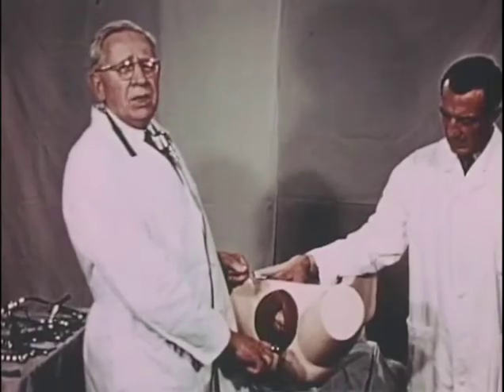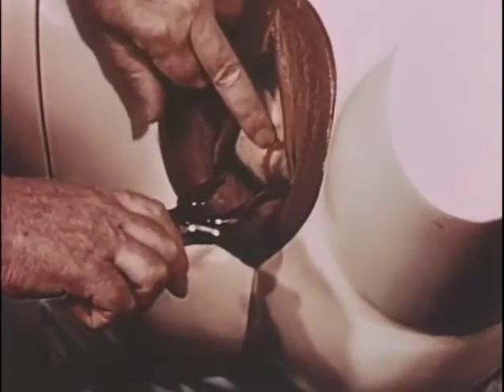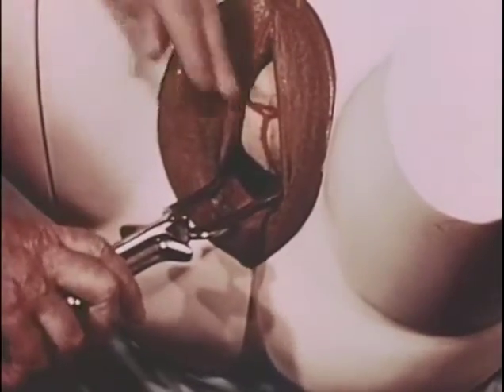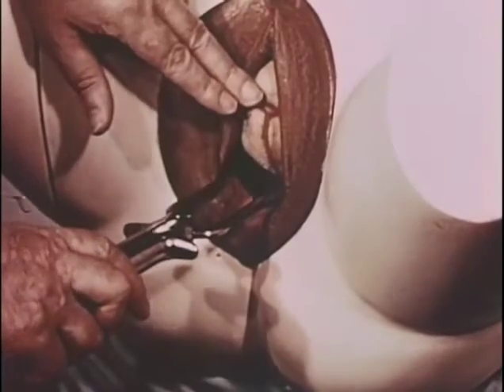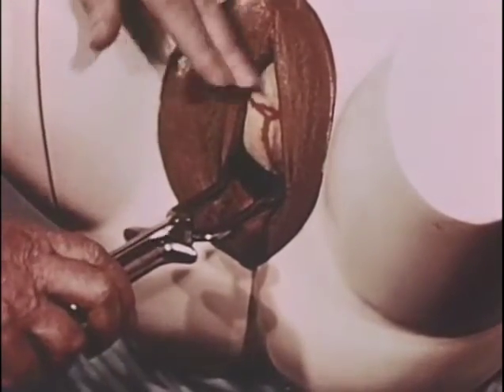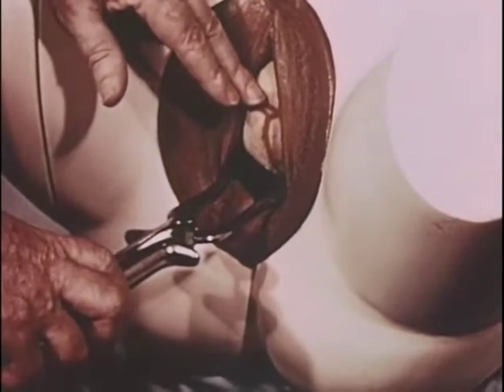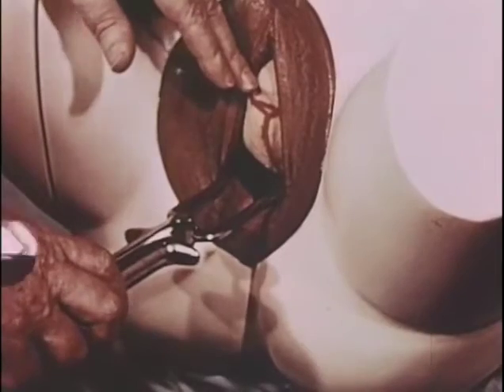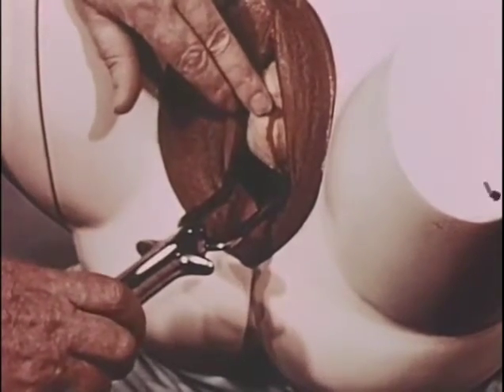Recheck the application. Posterior fontanelle. If we find that the posterior fontanelle is more than the finger's breadth anterior to the plane of the shanks, we know that this is eccentric application. The blades are too far on the face, and the toes go back too far towards the angle of the jaw.